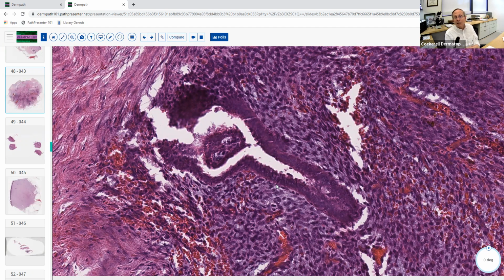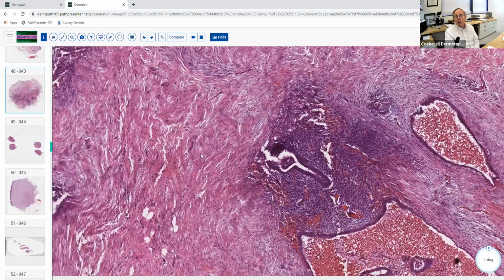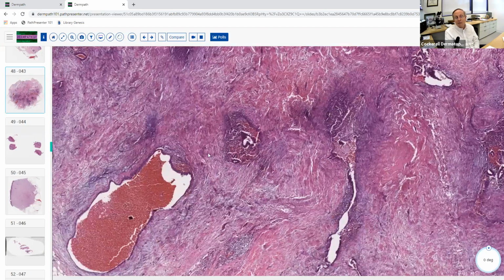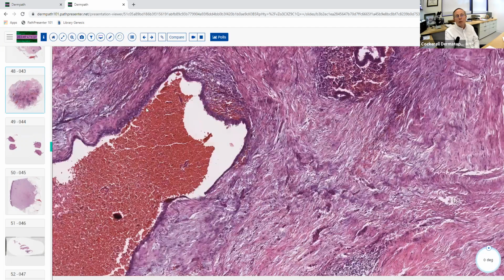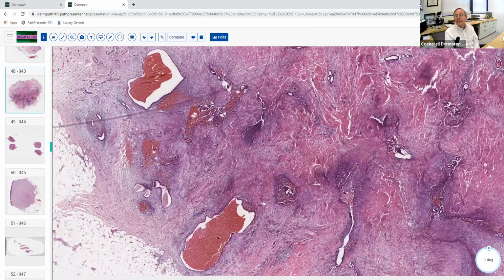And we always name cysts by the lining. Okay, so again, this is not a cyst. It's really multiple glandular elements here. But when you look at a cyst, you always look for the lining, and then you make a diagnosis based on what the lining of the cyst is. But this isn't just a cyst. This is multiple glandular epithelium.